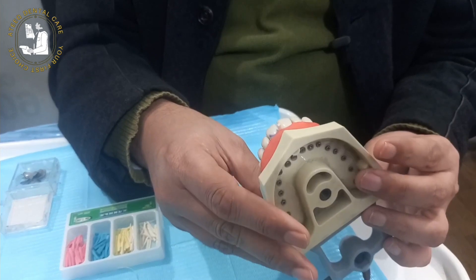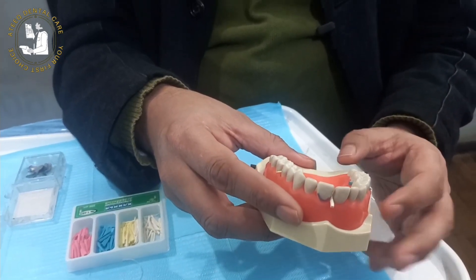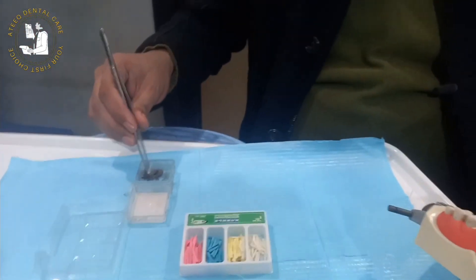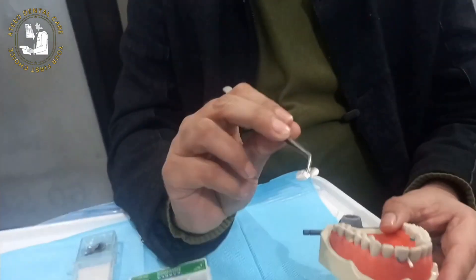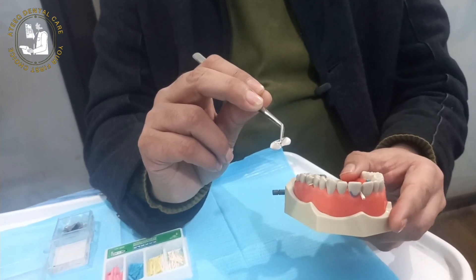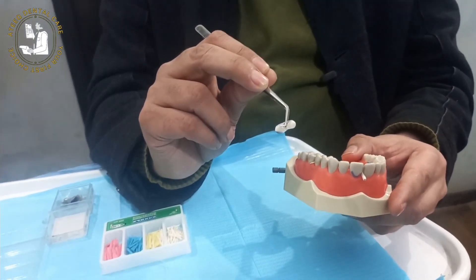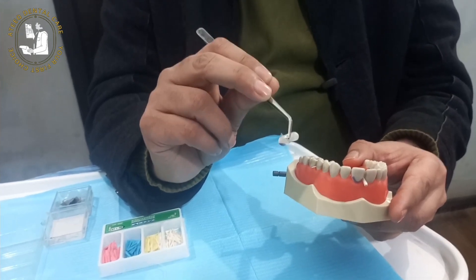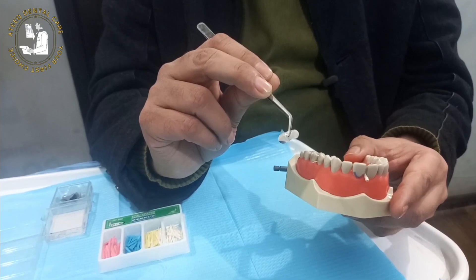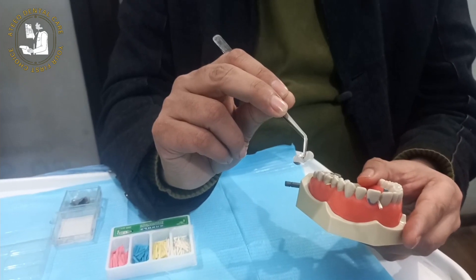Today's lecture is very important as usually dentists miss the placement of wooden wedges. They just place the matrix band without wooden wedges, and the ultimate result is an overhang of the restoration. The restoration will be overhanging and impinged on the interdental papilla, and there will be food impaction that will destroy the restoration.